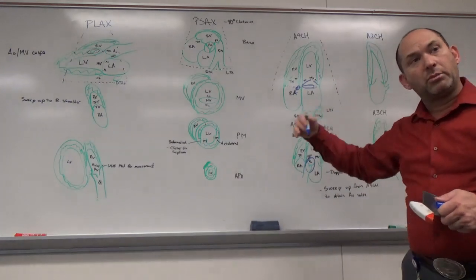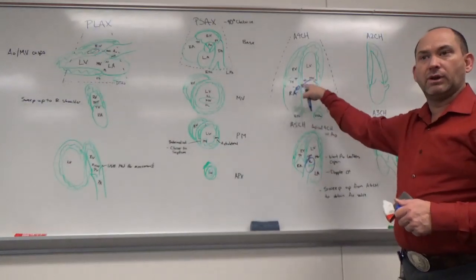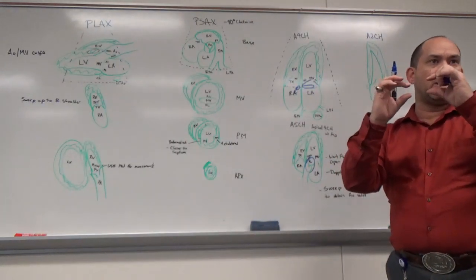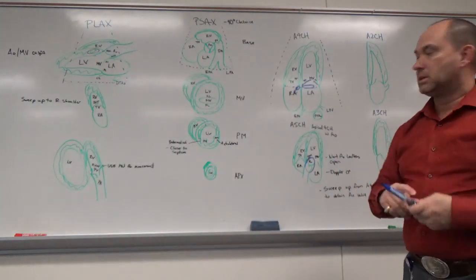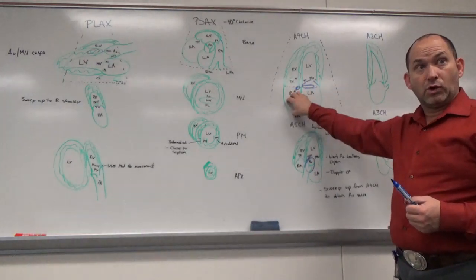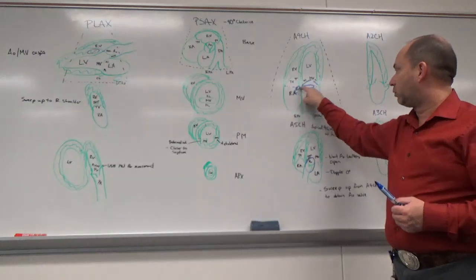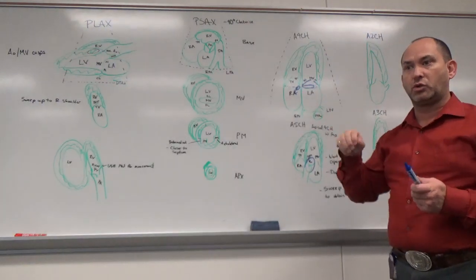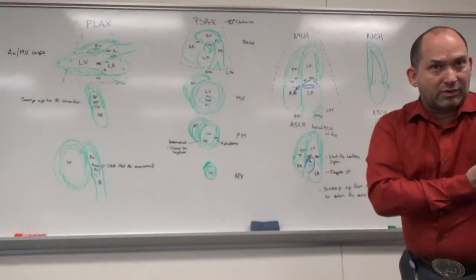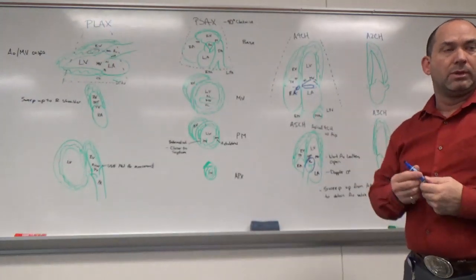But if I'm too far posterior, I see an almost tubular shape of a blank space there, the fluid-filled space. So if you're seeing a right atria that looks like it's full, but on the left side I see this weird long thing like this, that means that you're twisted wrong, and you need to come from posterior and twist it up more that way to open the atria.